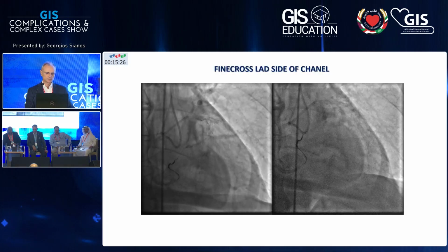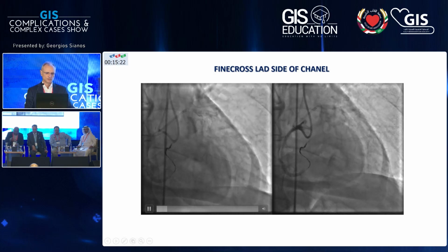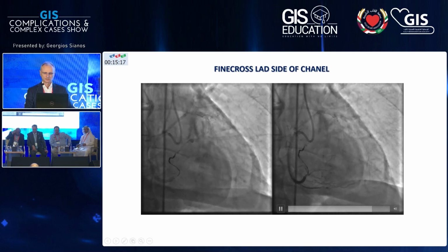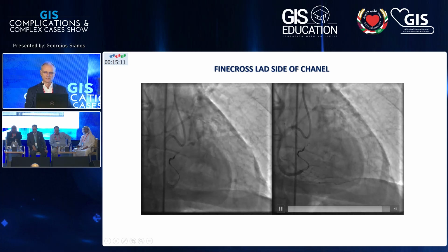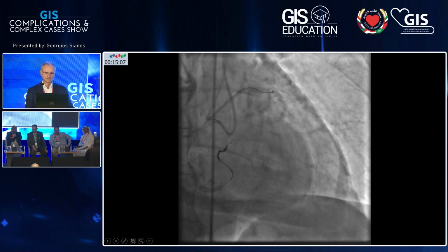And then it looks like from one side, the flow of this collateral to the perforation site is getting less, but it is obvious that there is a filling communication from the other side, and you see the same microcatheter now from the left side. You make a tip injection in the collateral from the left side, you can see it here.